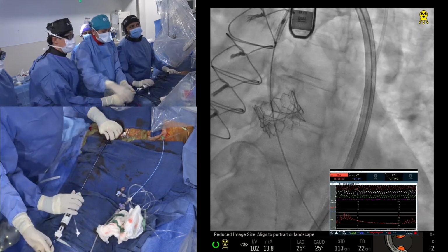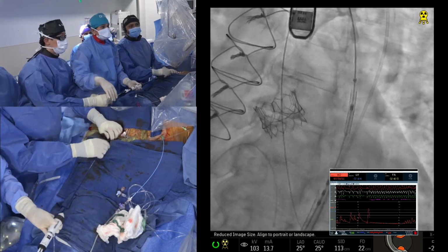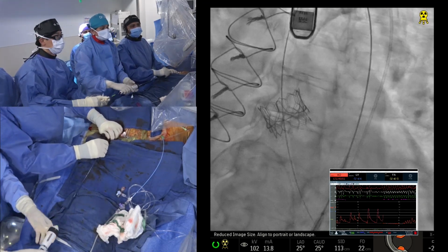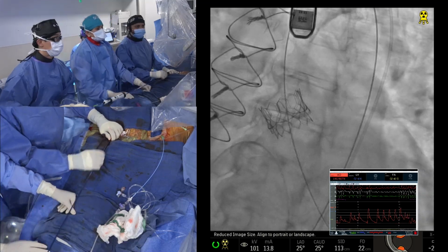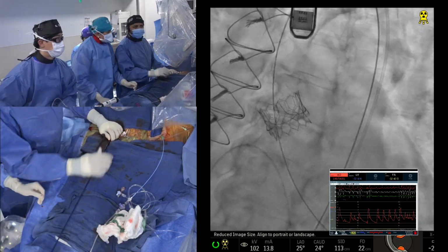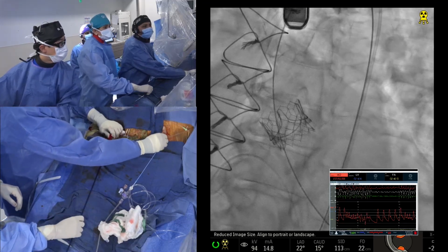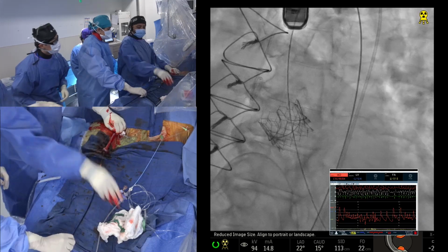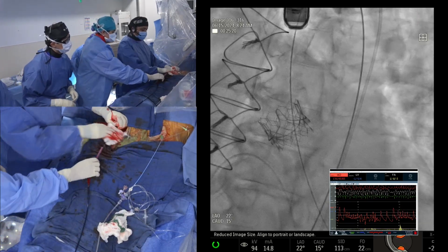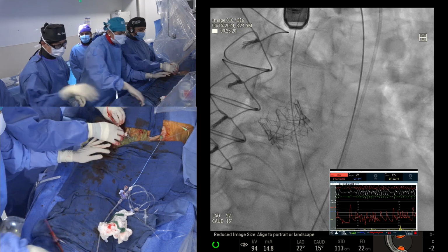Pigtail ready, please. Come down slowly. Unflex, yes, unflex completely. Get the pigtail. I was supporting this double inflating twice, because even for stents it has been well demonstrated that two inflations get you a larger MSA, and of course with stent in stent or valve in valve, it's clearly the right option.